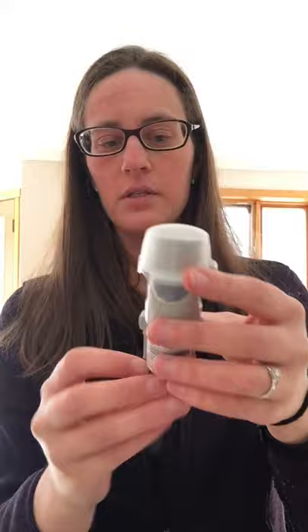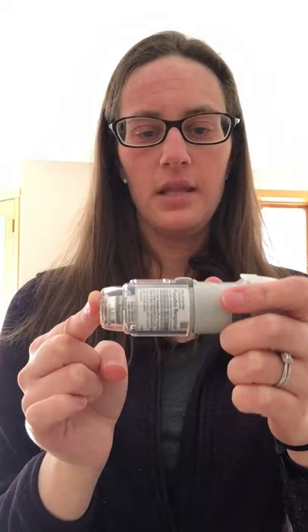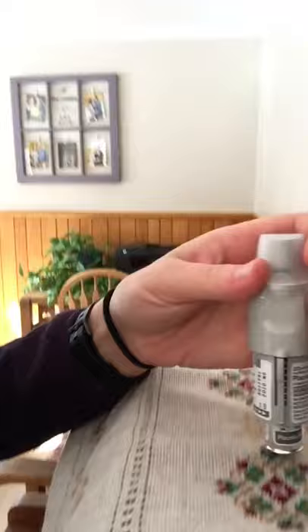An important thing to note is that a lot of people will insert it and think there's some resistance, so that must be as far as it goes. Then they put the cap on and think it's ready to go — that's incorrect. This canister needs to be pushed in all the way until it's almost flush with the bottom. I often recommend using a hard tabletop in order to push down on it with some force to actually get it in. And as you can see now, the canister is almost flush, just sticking out a tiny bit.